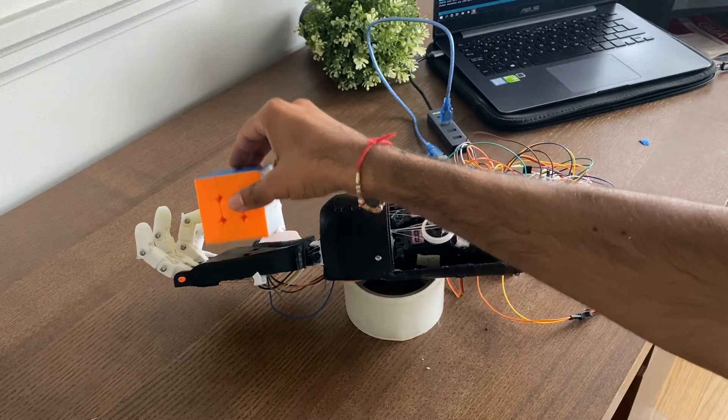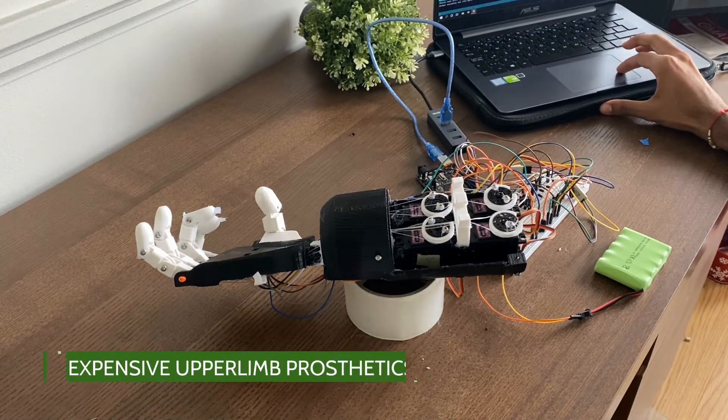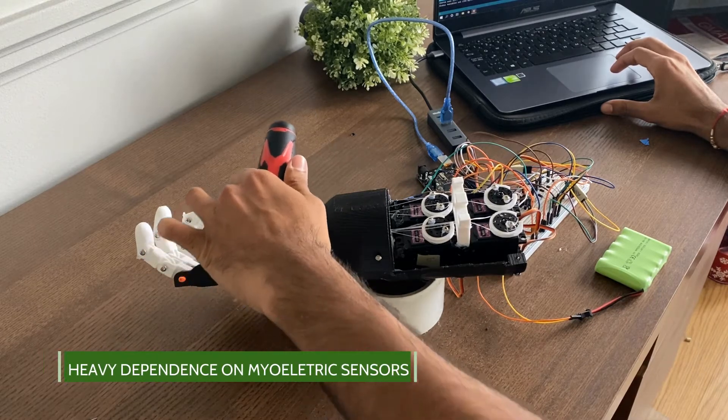This arm was initially developed to challenge two issues in the upper limb prosthetic space. One was the exorbitant cost associated with upper limb prosthetics, and two was the heavy dependency on myoelectric sensors.